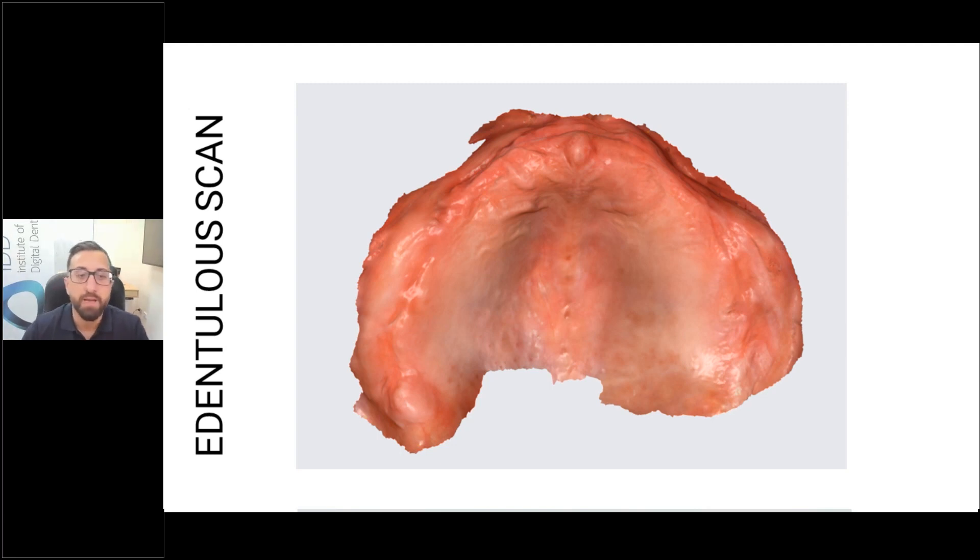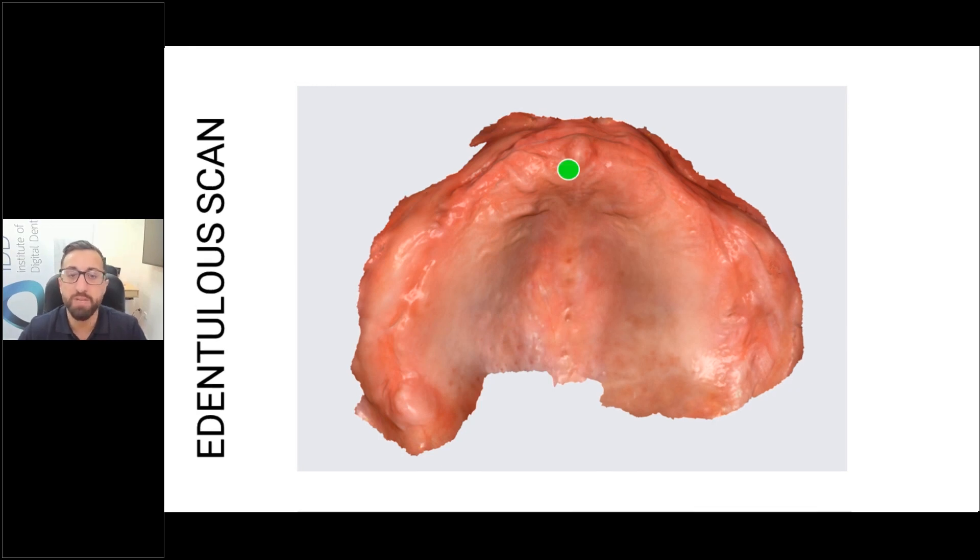Let's go over the scan strategy for a maxillary arch. You always start on the rugae, because that is where most of the really key information and obvious landmarks for the scanner are. If you scan a featureless area, it can look the same as another area, so you can start getting stitching errors. Starting on the rugae gives the scanner more data to connect all the images together.